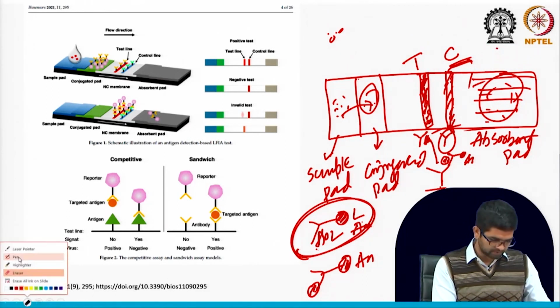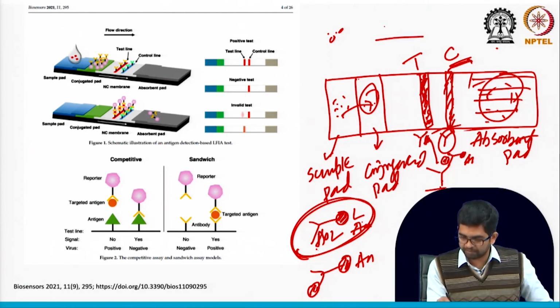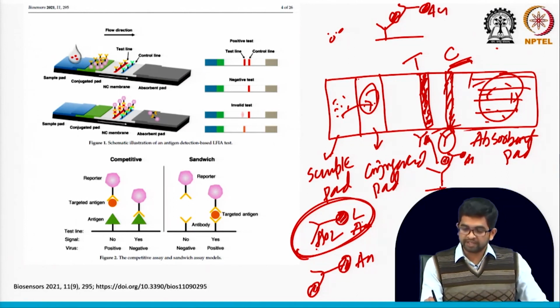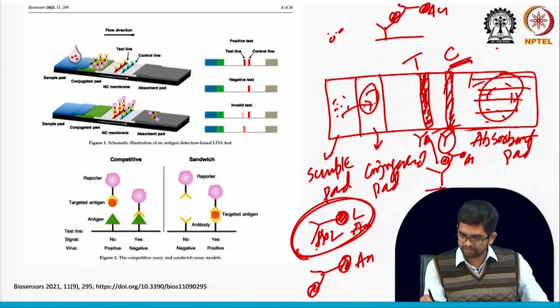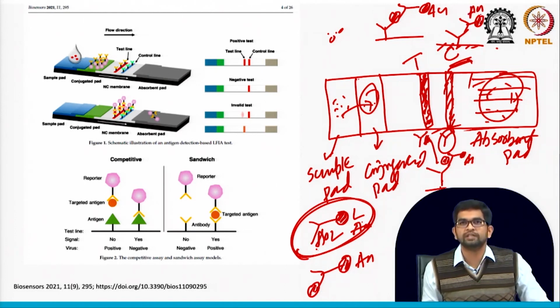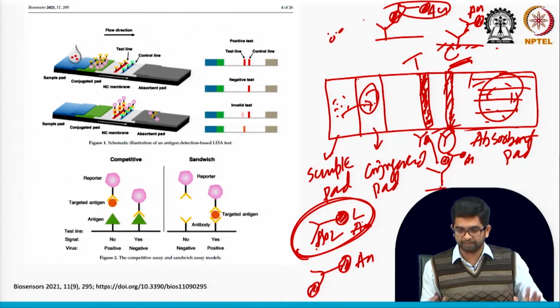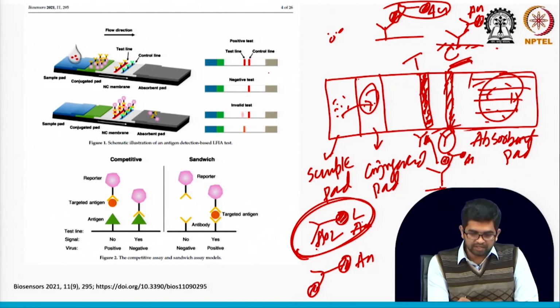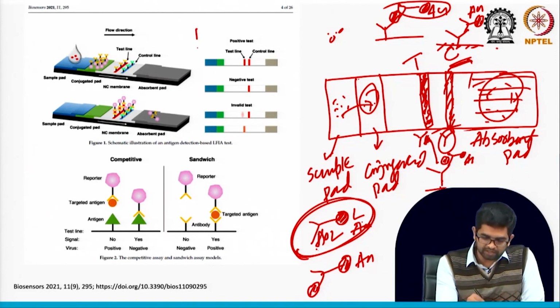Let us see. In the test region case, the main basic biosensor is like this, gold, okay. But in the control region, the main basic biosensor is this, so gold, right. So, here without target it can bind, here with target it will bind the secondary antibody conjugated to gold. This is the main mechanism. See, you can see here.